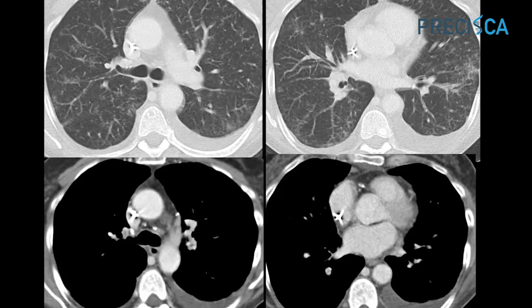So one of the things that we always try to look out for, in addition to lymphangitic carcinomatosis, which would be hematogenic spread to the lymphatics, is to look for this appearance of these kind of branching small vessels that may represent a microembolic disease. These patients usually are very symptomatic, and so discussions with our medical oncologist or radiation oncologist or surgeon usually allow for the diagnosis to be achieved.